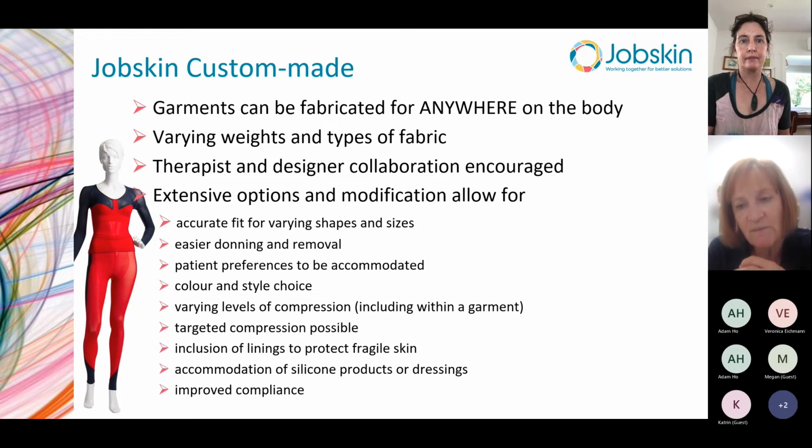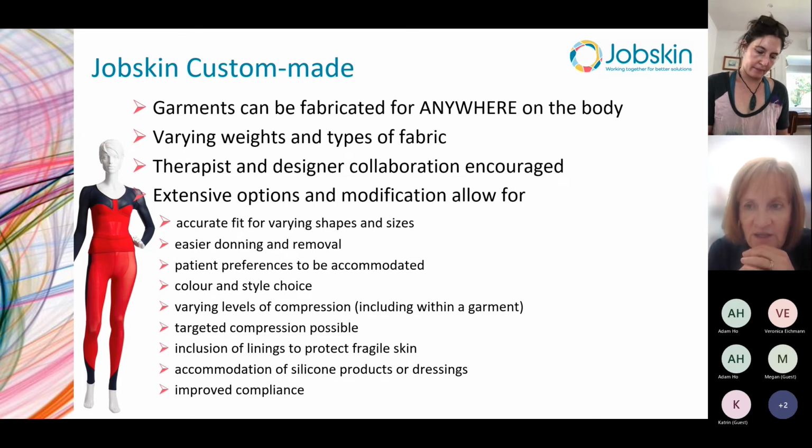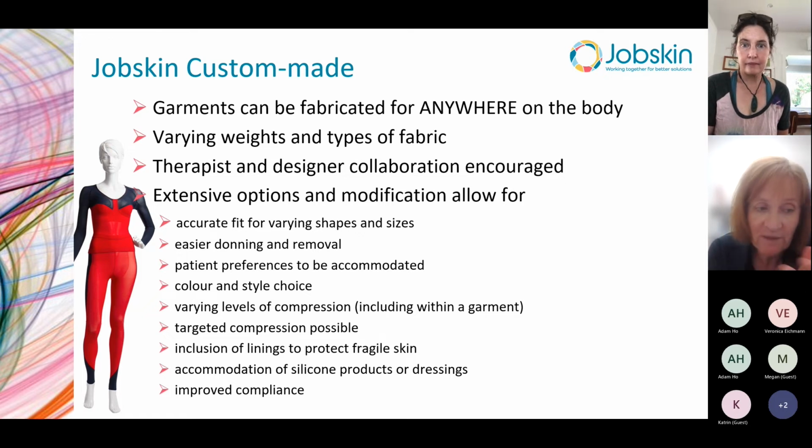And, in retrospect, it might have been a good idea for me to include something specifically about Cylon-Tex in this particular webinar. Cylon-Tex is a silicone lining that can be stitched into the garment, and it does last the life of the garment. When I first saw it, I just thought, why would I stitch silicone in, when silicone lasts 4 to 6 weeks when you think of something like silicone sheeting.